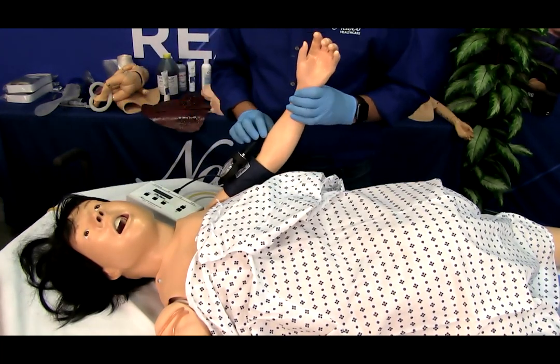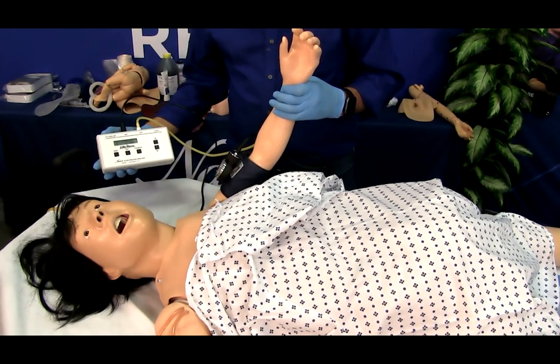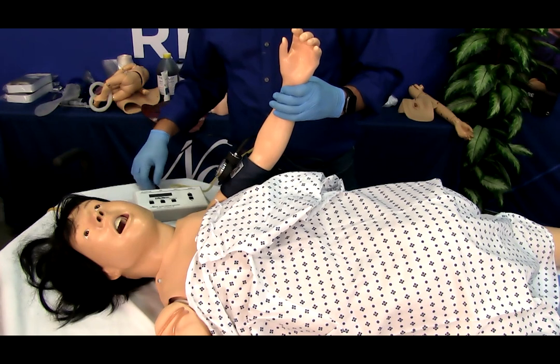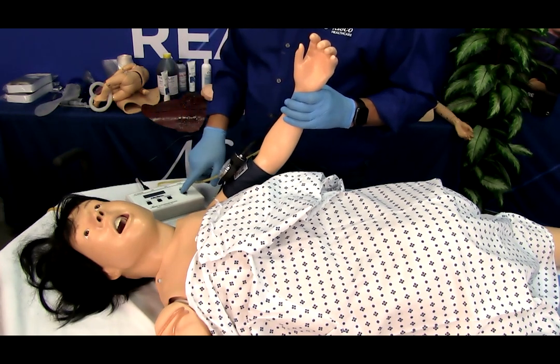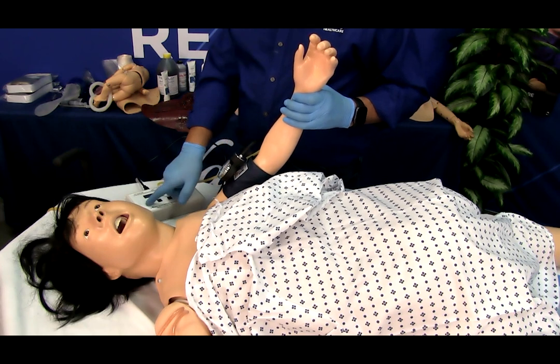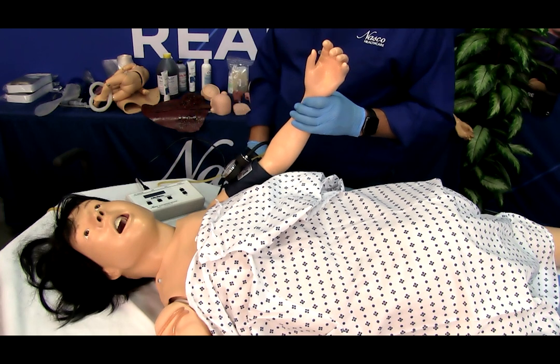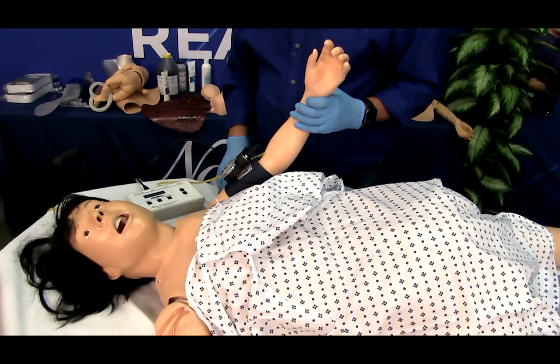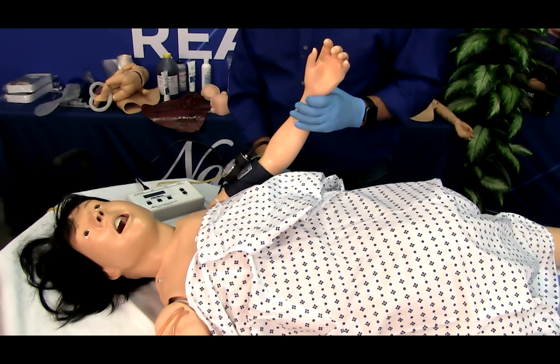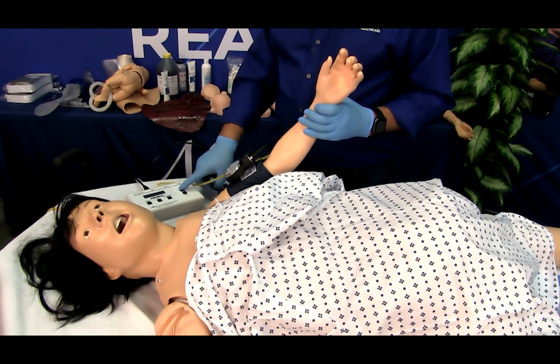The Set Palpation menu will display in the electronic control unit window. Pulse on is the default. Use the down arrow key to the right of the menu key to set palpation to pulseless. The palpation can be set either on or pulseless. When the pulseless setting is used, the diastolic and systolic pressures will automatically be set to zero. Use the up arrow key to the right of the menu key to set palpation as pulse on.